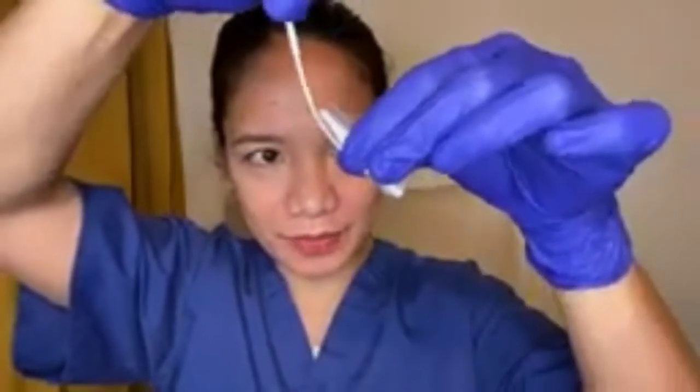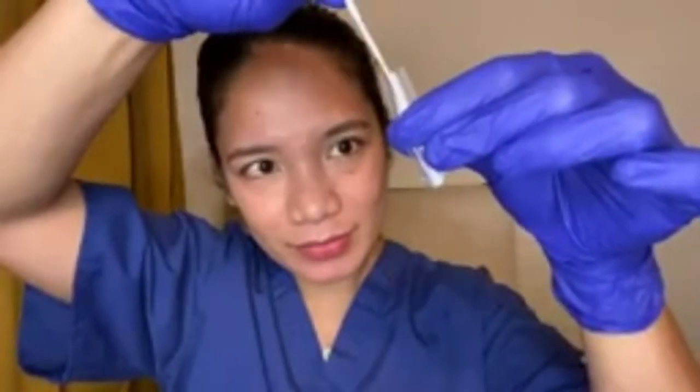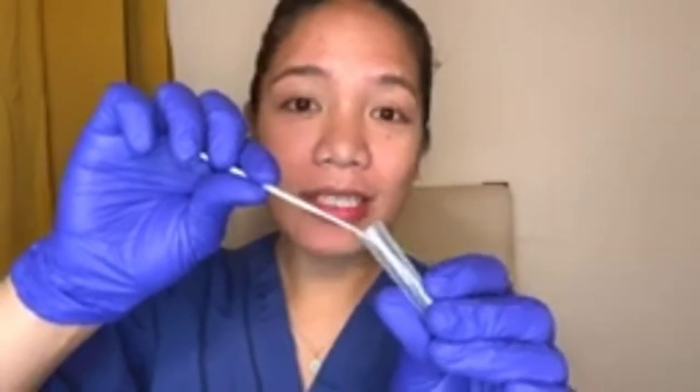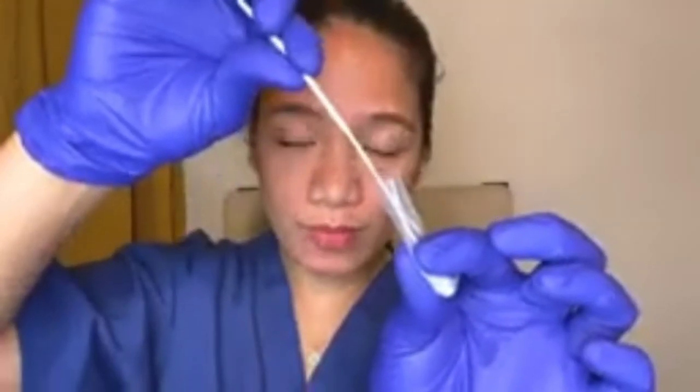Now that we're done, grab the tube with the solution and put the tip of the swab inside, then slowly rotate it for at least 6 seconds. Assuming 6 seconds is done, gently squeeze the bottom of the tube, ensuring the solution stays at the bottom and doesn't stick to the tip of the swab. Then dispose of the swab properly and cover the tube with the cap — it has a hole in the tip.